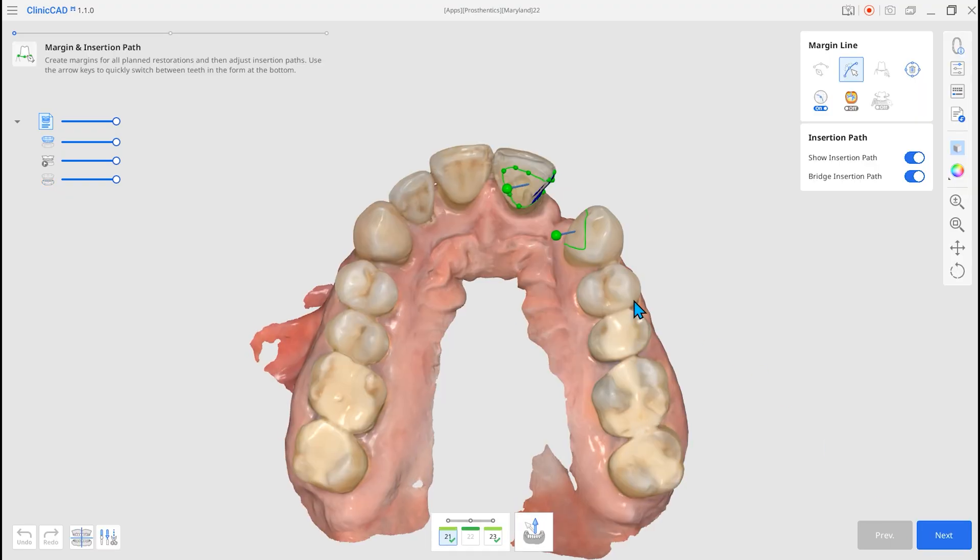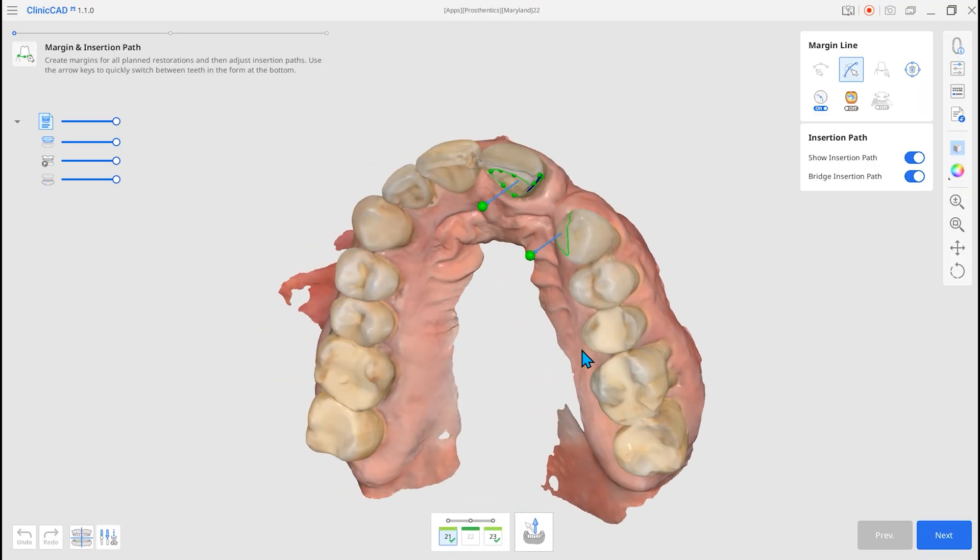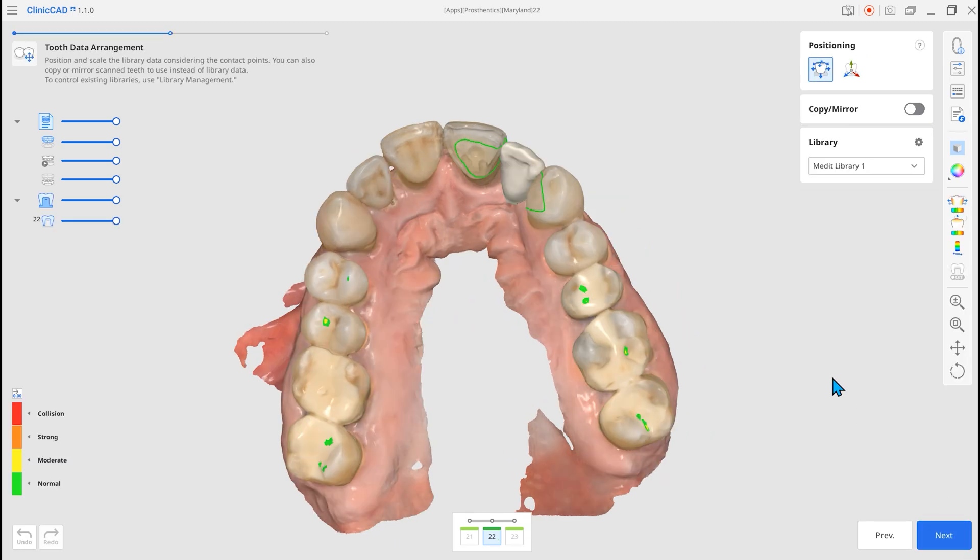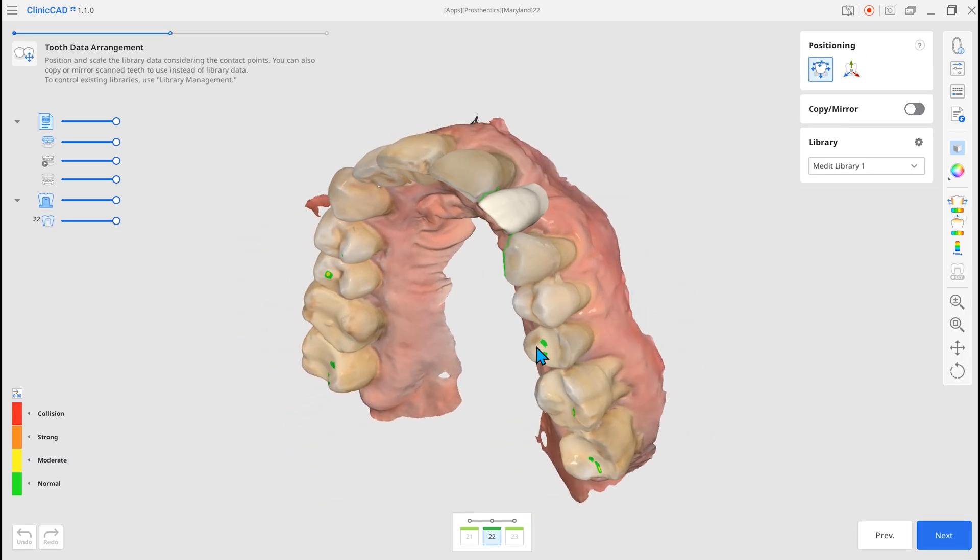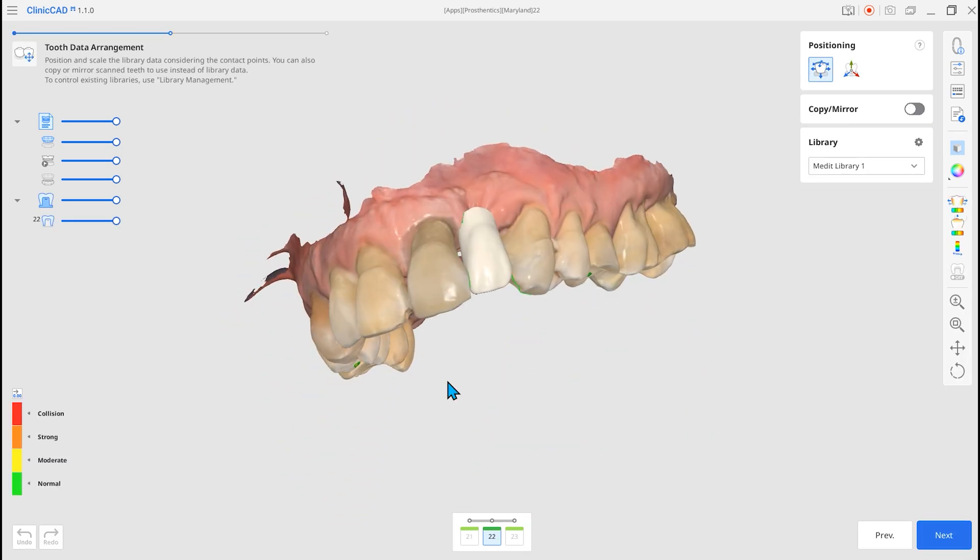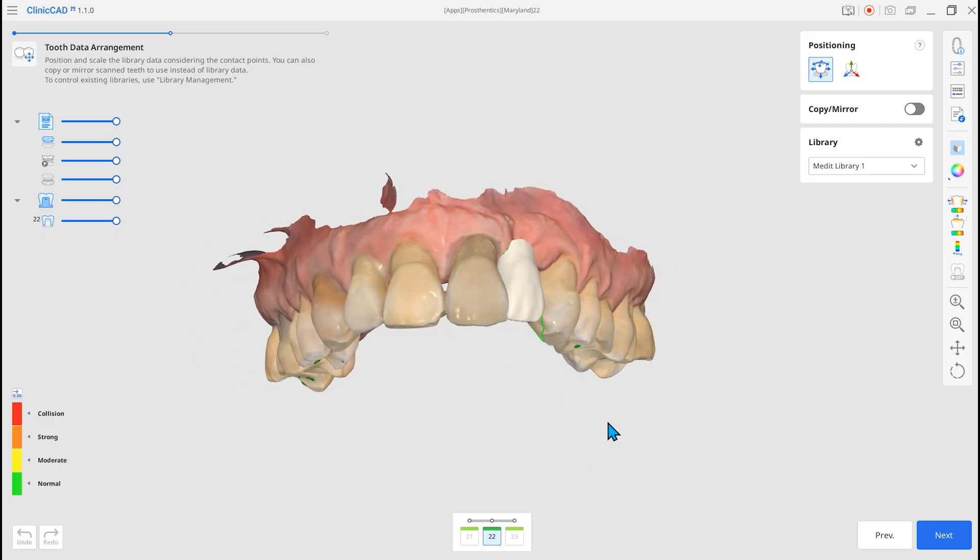Then set the margin line and the insertion path for the Maryland Wing. You can also adjust the position and size of the Maryland Pontic, and assign the library.